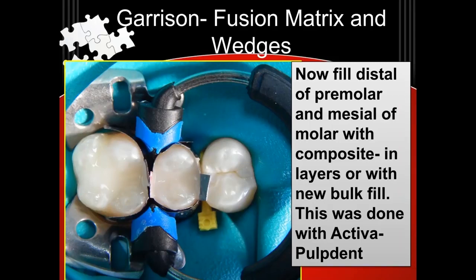What I was going to ask you about, Dr. Cannon, is when we were filming you mentioned how on that premolar the bands overlap and how you deal with that sometimes. Yeah, in fact you see how I did take care of that — they do overlap. You can do one of two things: one is you can slide one in, then slide the other one from a slightly different direction. So if you slide one in more from the palatal, you start the other one more from the buccal, and they kind of overlap naturally. So what you have here is a double thickness.